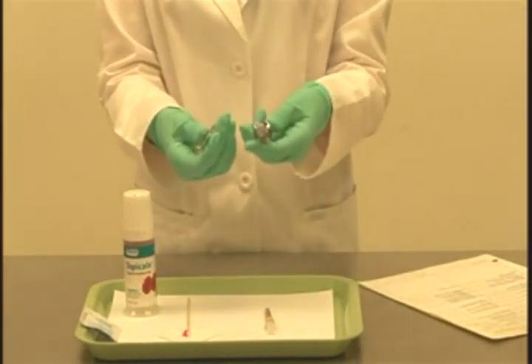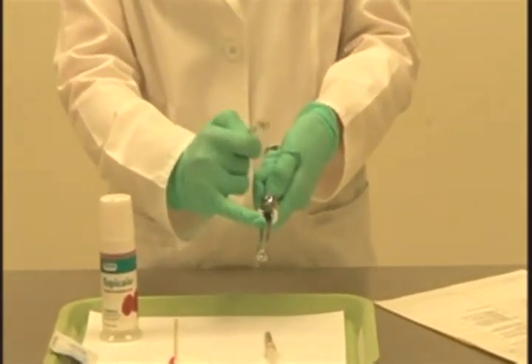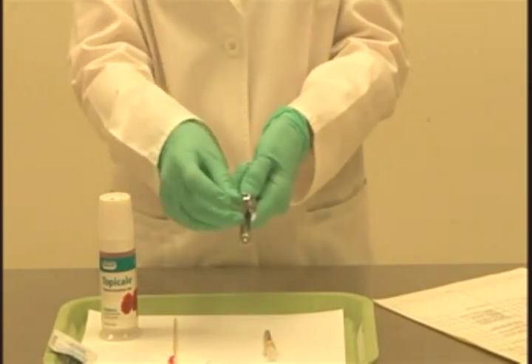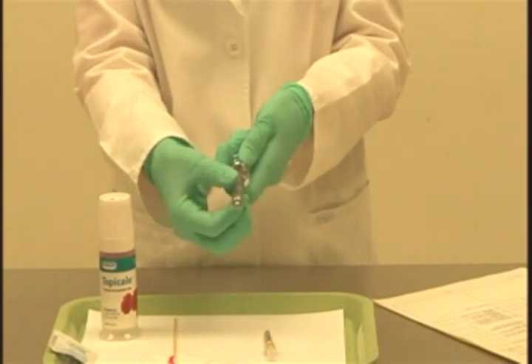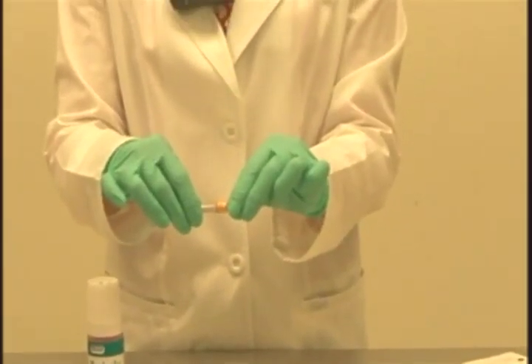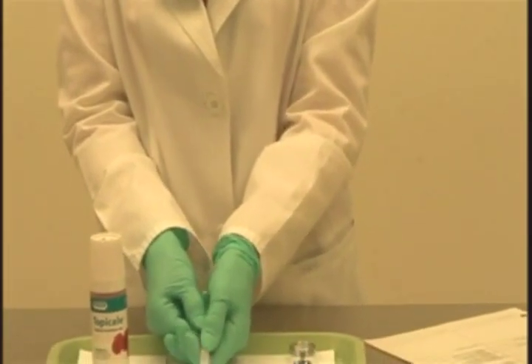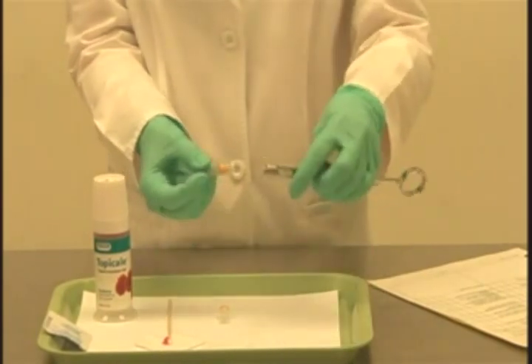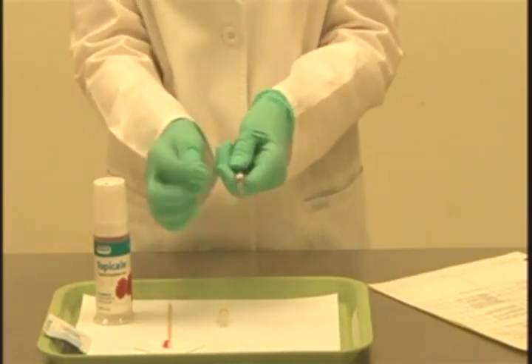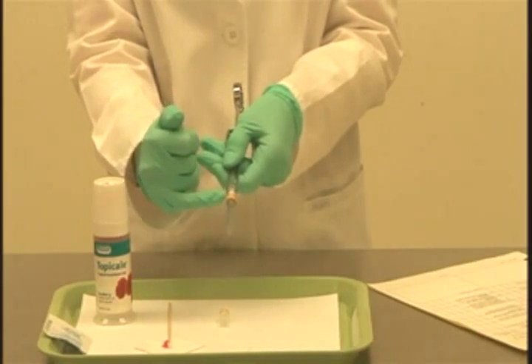Now I'm going to place the carpule into the syringe. I'll hold the syringe in a palm grasp and pull the thumb ring out of the way to open up the barrel. The rubber stopper end goes next to the piston. I position it and release the thumb ring so the carpule is now seated. To attach the needle, I first break the seal by twisting the ends in opposite directions, then gently loosen the protective cap so it falls onto the tray. I insert the needle and, holding firmly at the hub, attach it to the syringe, making sure there is no gap between the needle and the syringe.